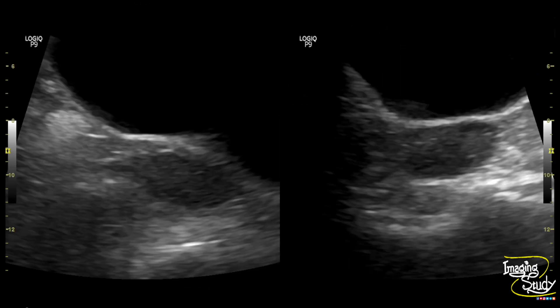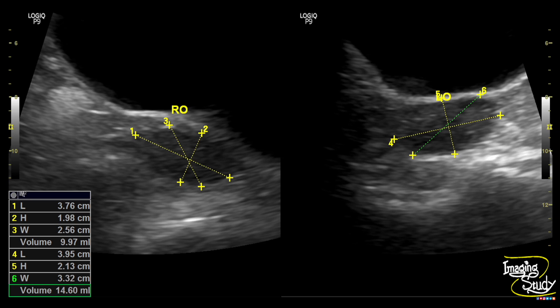Here is the picture of the right ovary on the left and the left ovary on the right. There is no dominant follicle noted within either ovary, and you can see these tiny follicles at the peripheral part. The volume measures around 10 cc on the right and 14.6 cc on the left, which indicates bilateral ovarian enlargement.